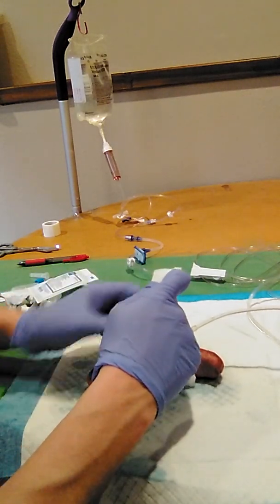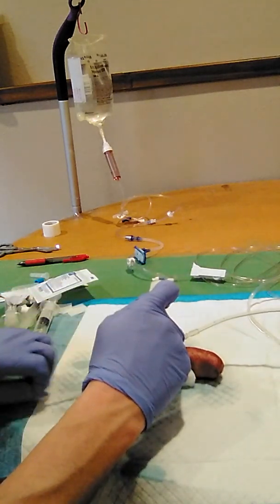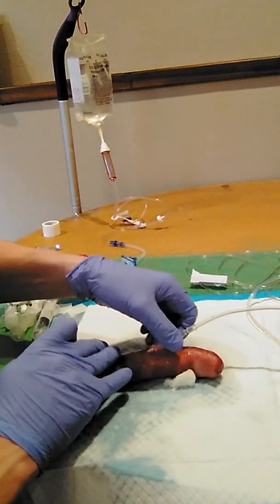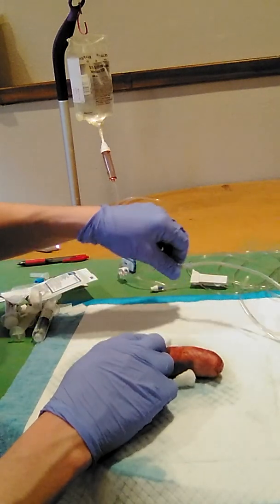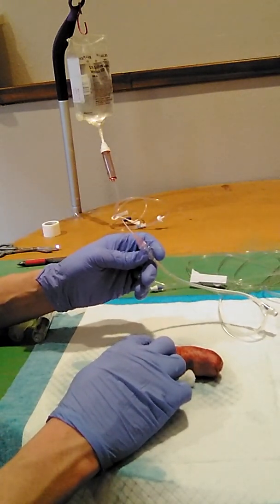Okay, I'm doing that chevron. And just double checking that the valve is locked. So we'll withdraw the catheter from the vein. Okay, applying firm pressure on this for about 3 minutes.